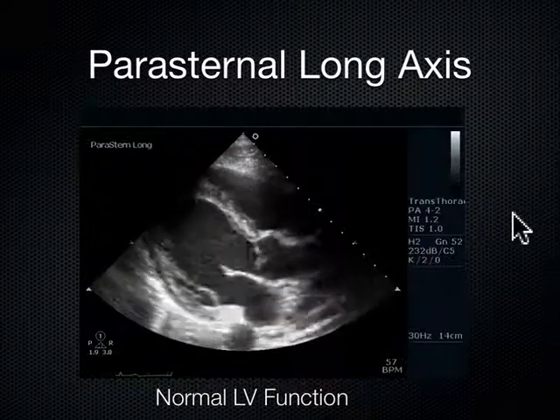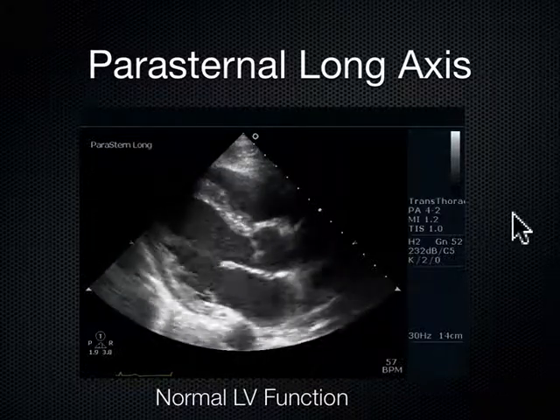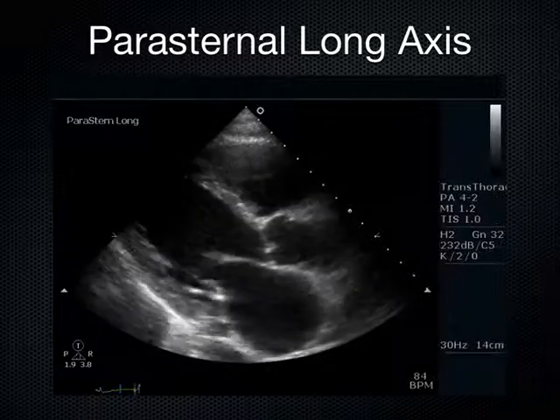Quantitatively, I think the cardiac output stuff we're about to do is very useful. Ejection fractions, I don't know. I just like to look at these hearts and decide what I'm going to do next. How about this one here? Medications or fluids?